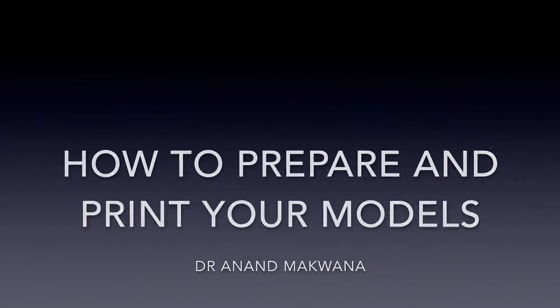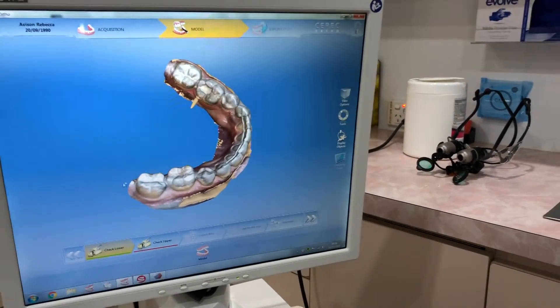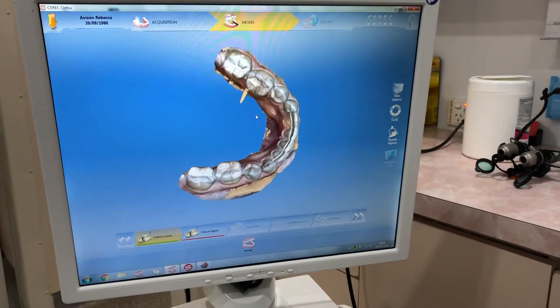In this video I'm going to show you how to prepare your digital models for printing on a Moonray 3D printer. So now that you have your Cerec Ortho model, how do you get it to print?